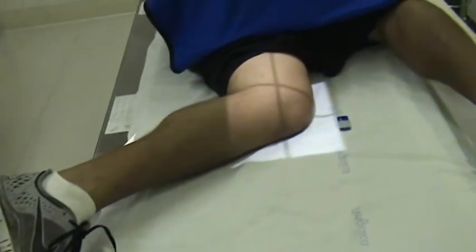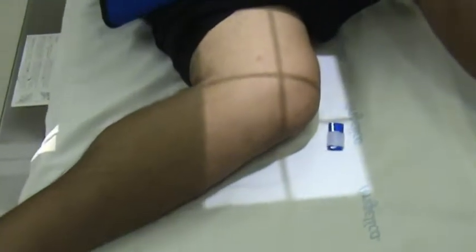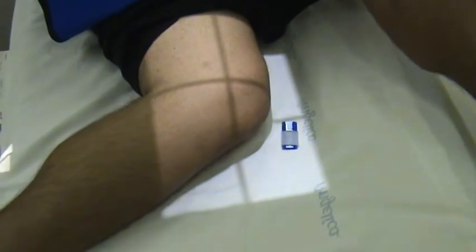Here we go. You also want some light around the area. Make sure that your patient's leg is not rotated internally or externally more than it has to. You want your condyles to be superimposed, and over rotation will cause them to not be perfectly superimposed. Collimate to the area that you need and make sure your marker is anatomically correct.